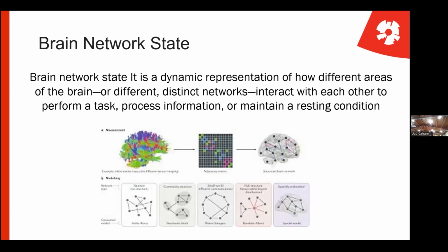The second piece of information is the brain connectivity. Now, all these areas interact with each other, and they interact differently depending on what we are doing. So we have those areas, but these areas talk to each other. We want to understand how they talk to each other during a postural control task and between Parkinson's and healthy individuals.